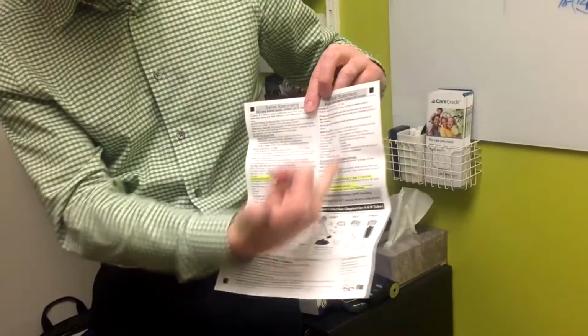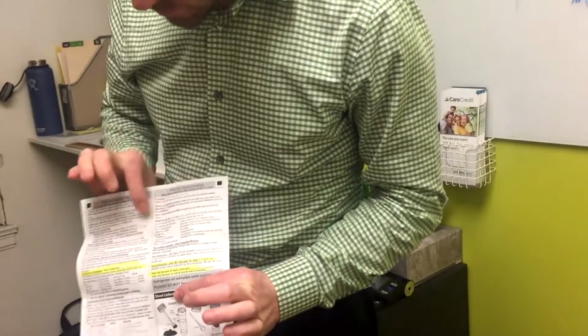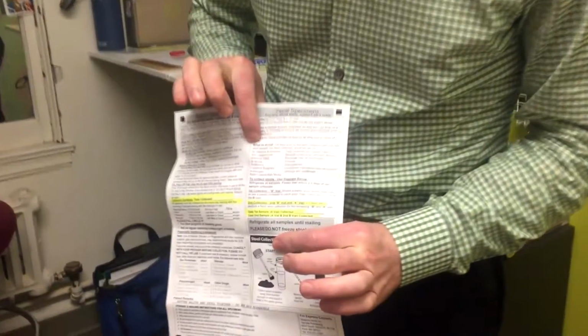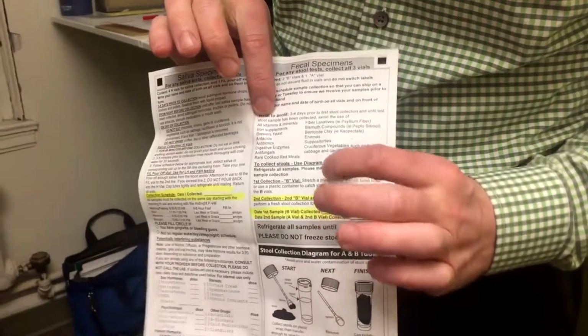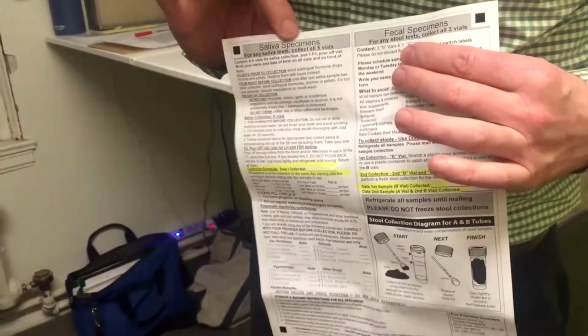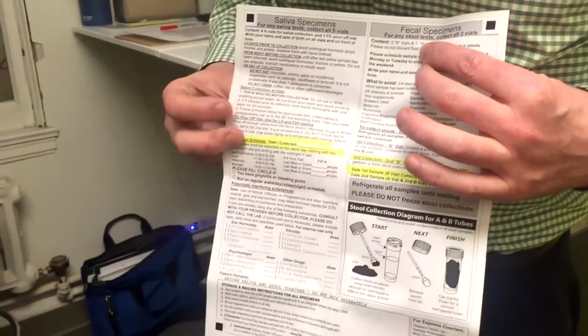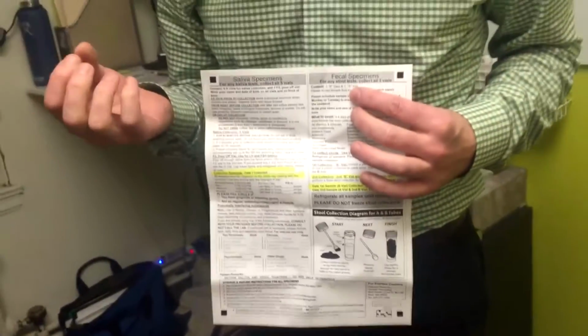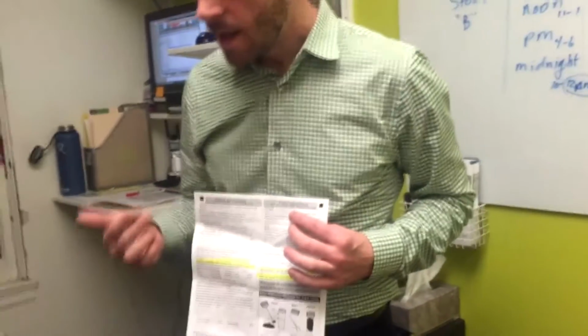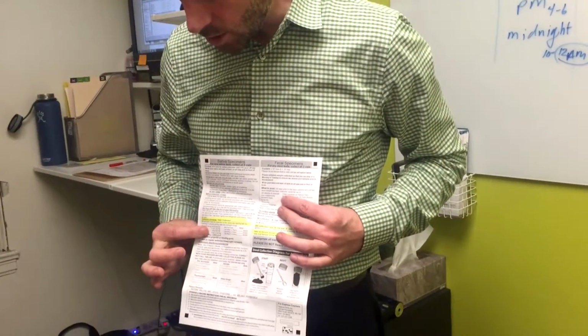On the right column is the fecal specimens. There, you want to pay attention to, there's foods to avoid 3 to 4 days prior. That's real important because that'll mess up the stool collection. On the saliva collection on the left column, there's also some things you want to avoid on the day before and the day of. Mainly, you want to avoid caffeine or any stimulants because that'll mess up your hormones. And no chocolate because that has caffeine in it. And no Pepto-Bismol or bismuth or antacids either. That'll mess up the results. But just make sure you read through all these instructions.